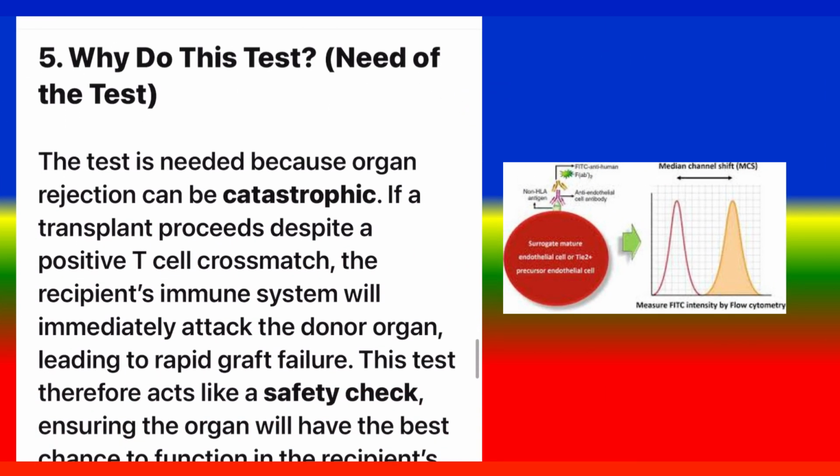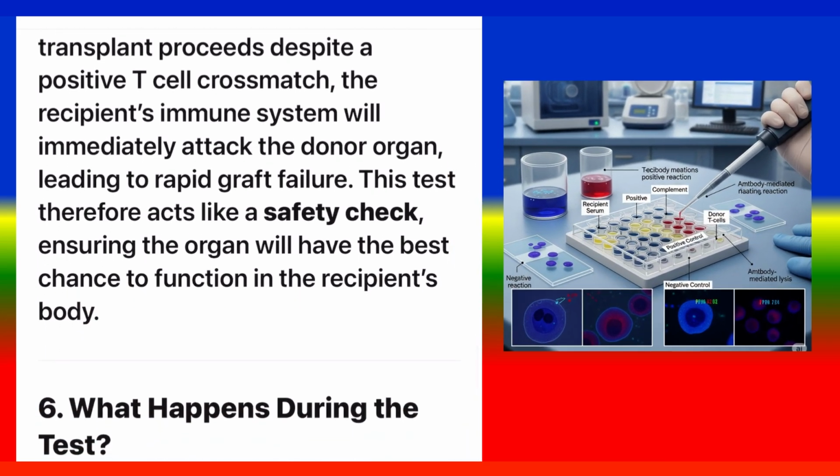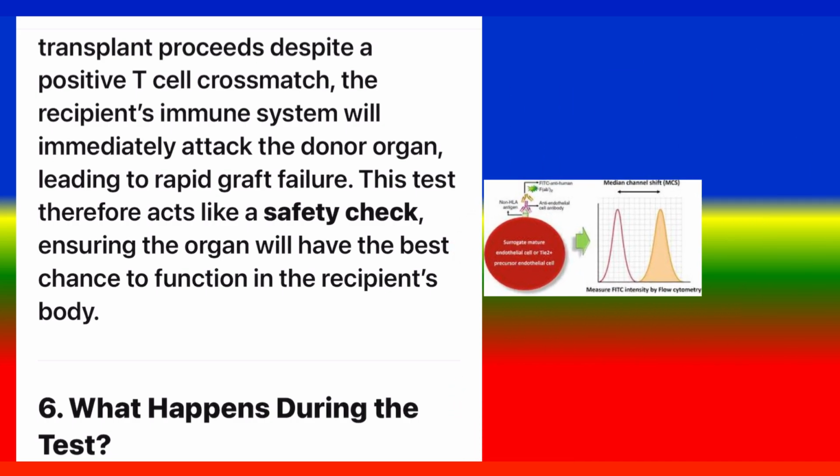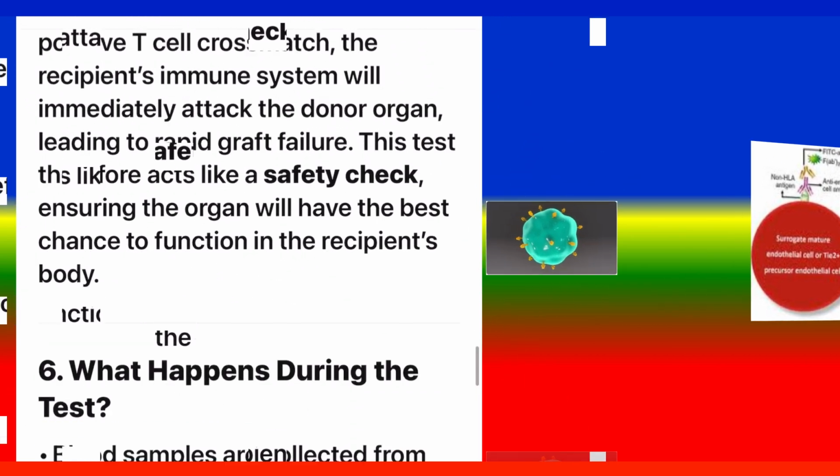5. Why do this test? Need of the test. The test is needed because organ rejection can be catastrophic. If a transplant proceeds despite a positive T-cell crossmatch, the recipient's immune system will immediately attack the donor organ, leading to rapid graft failure. This test therefore acts like a safety check, ensuring the organ will have the best chance to function in the recipient's body.